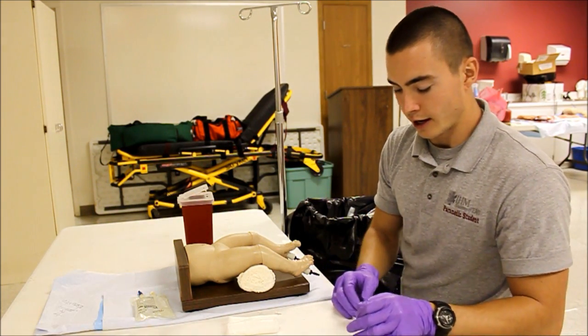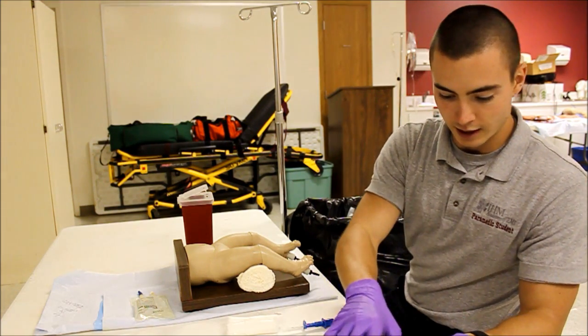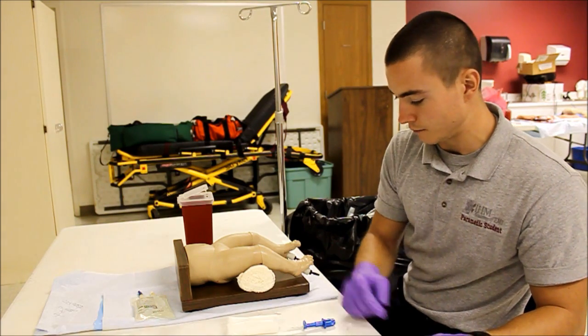I'm going to make sure that I have all my equipment and that it is functioning — make sure my IO needle is functioning, make sure that I have my stopcock, also my administration set and my saline flush.